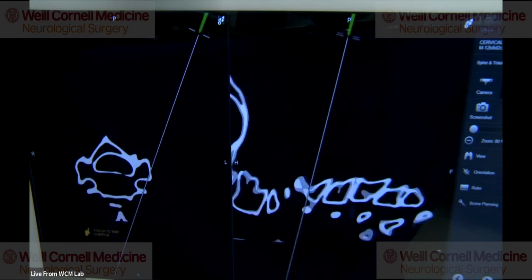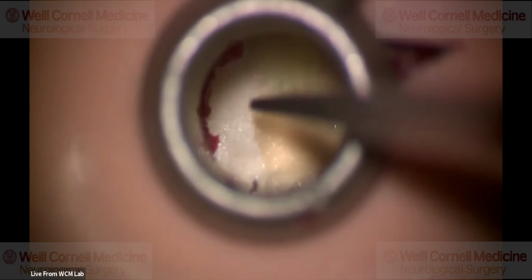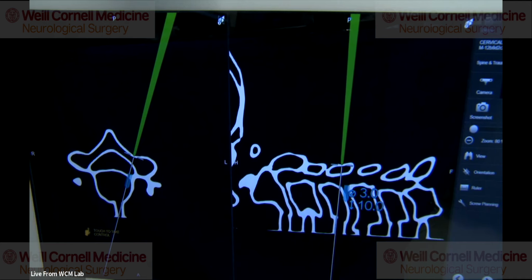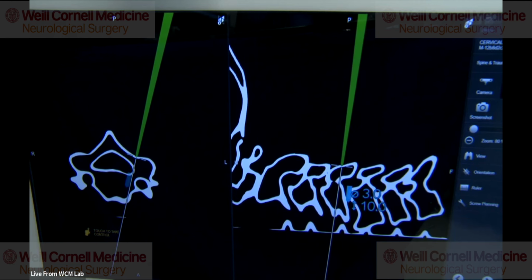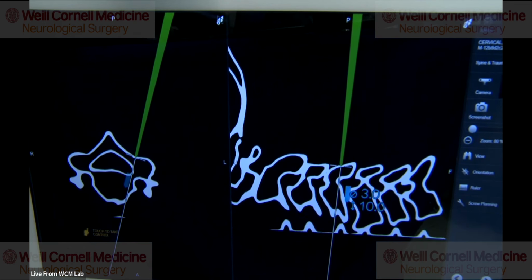Now I want to get a sense for how medial lateral, and that really depends on the pedicle. Eventually, as my bony landmarks, I want to find the pedicles. So this would be the medial caudal edge of the C4 pedicle. I look under the microscope so I know where that would be on the navigation screen.